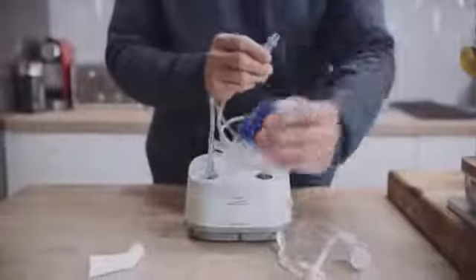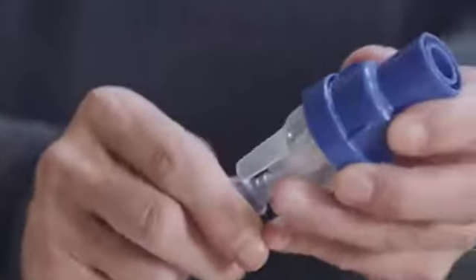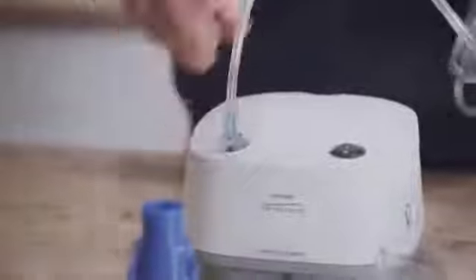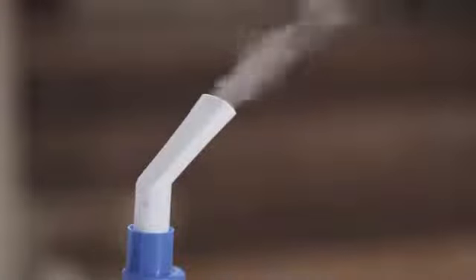Disconnect the SideStream from the tubing. Unscrew the top from the medicine cup. Rinse out the nebulizer and refill with clean water. Reassemble the top and medicine cup, reconnect the tubing, and run the SideStream again for a few seconds to flush out any drug trapped in the nebulizer jets.